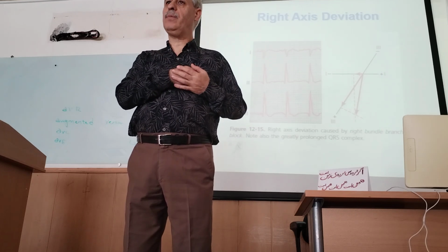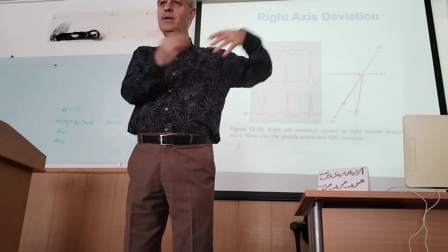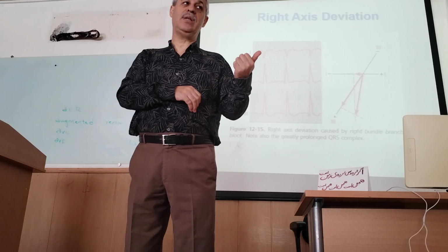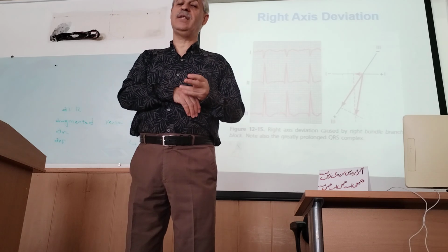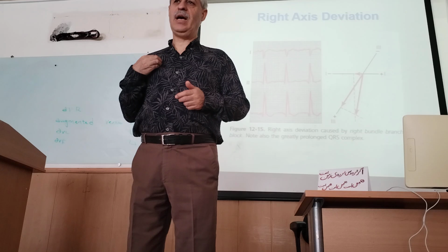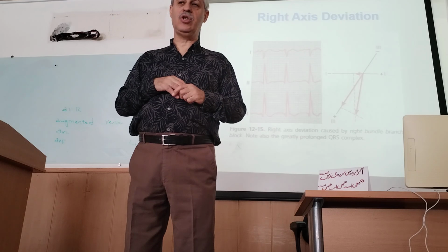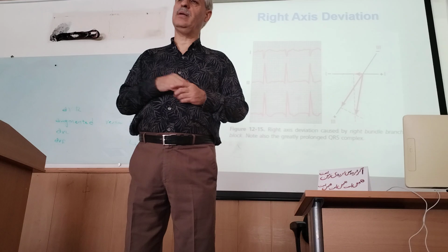Now, if we divide the armpit into three lines, anterior, mid, and posterior axillary line, the fifth intercostal space at the anterior axillary line would be C5, and the mid axillary line would be C6. So we have 6 chest leads in the horizontal plane. We have the horizontal plane and the frontal plane.